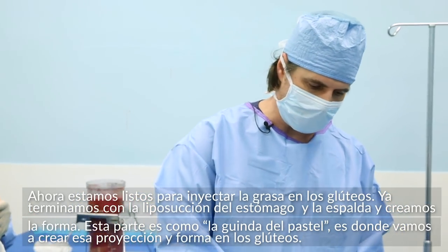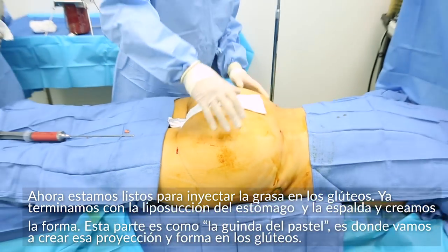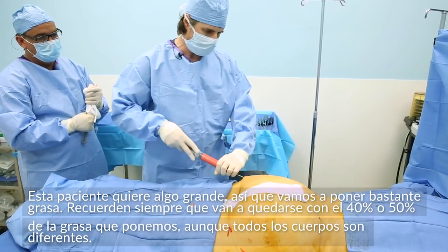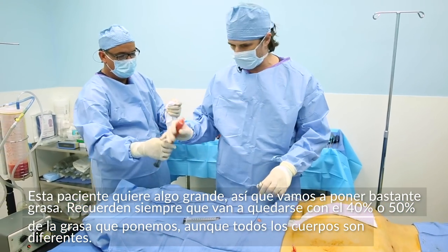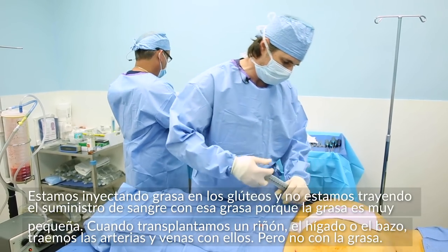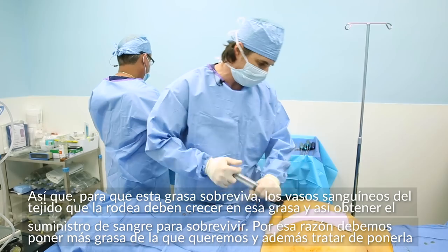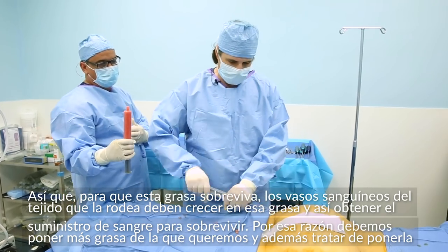Now we're getting ready to inject the fat into the buttocks. We've already done all the liposuction of the abdomen and back, so we've created that form around the buttocks, and now this is the icing on the cake — we're going to add that projection and shape. This patient wants to go on the bigger side. The key thing is that I'm not bringing the blood supply with the fat. When we transplant a kidney or liver, the main thing we do is bring the arteries and veins with it. For this fat to survive, the blood vessels from the surrounding normal tissue need to grow into the fat so it gets blood supply and can live.